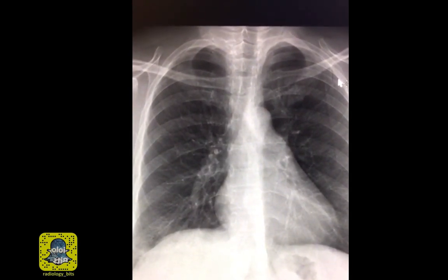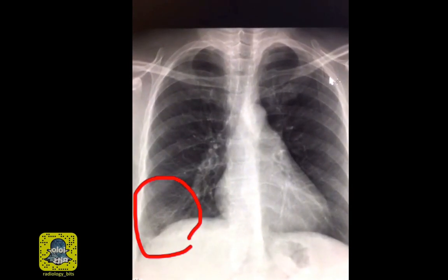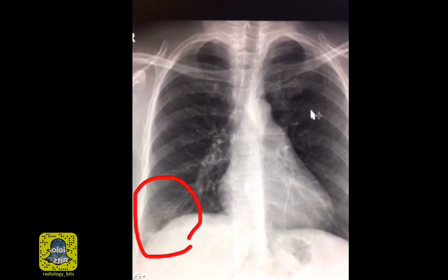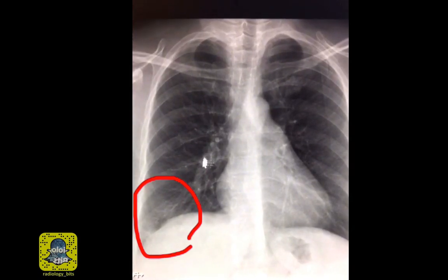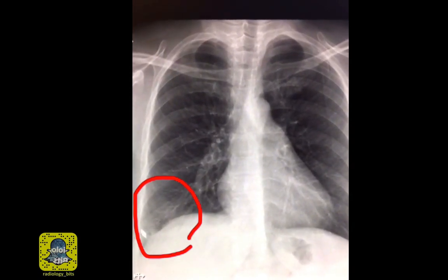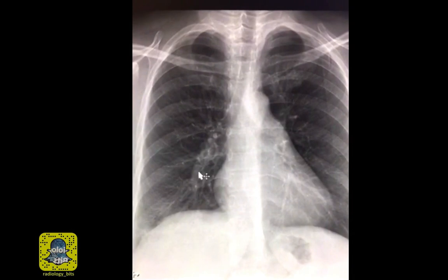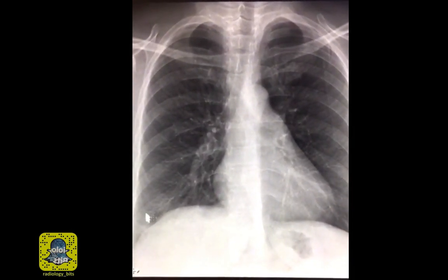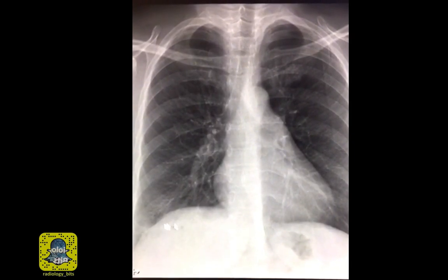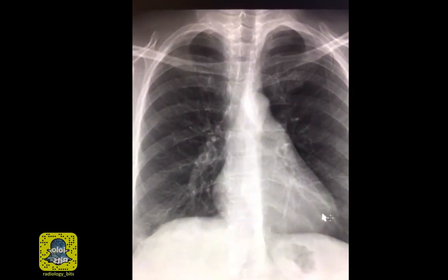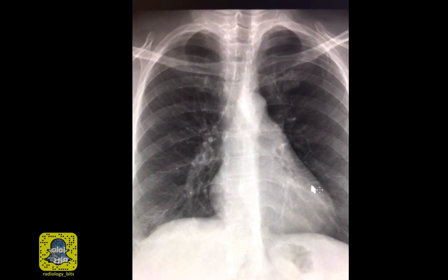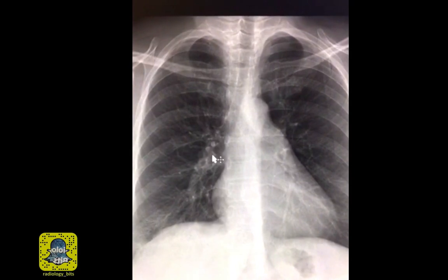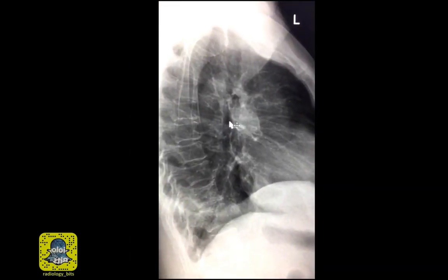With a bit of history on the patient: she presented with fever and cough, so you're practically making sure there's no pneumonia. At first glance you might not see anything, but comparing the left and right side, you'd wonder about this area here. See how the right and left side are equal in density, but there is minimal increased density in the right lower lung compared to the left. The first point: compare the left and right side whenever you're looking for opacities — that would be very useful.